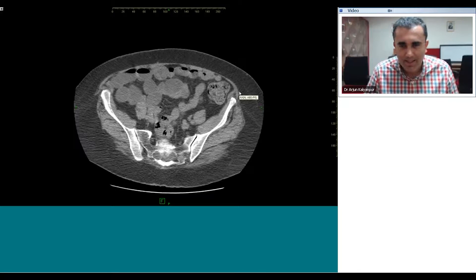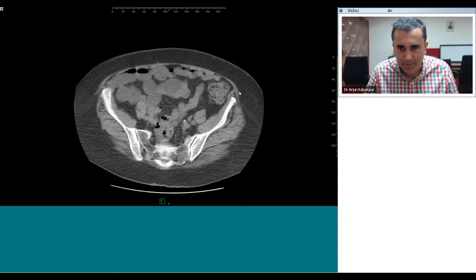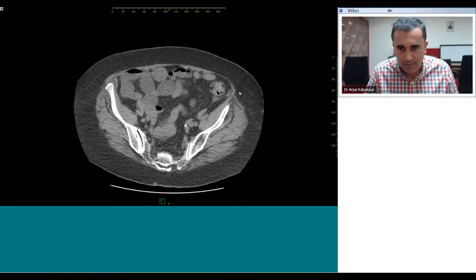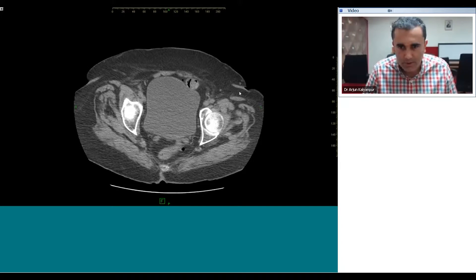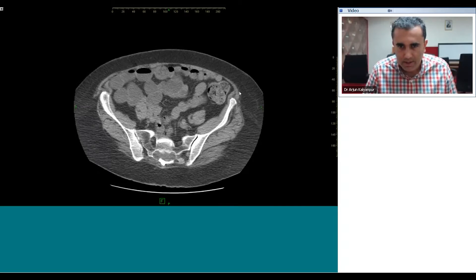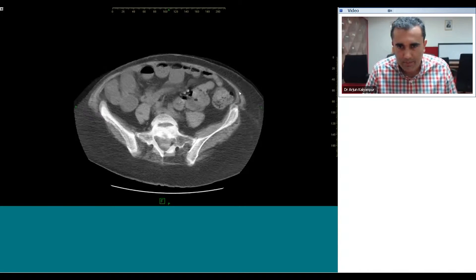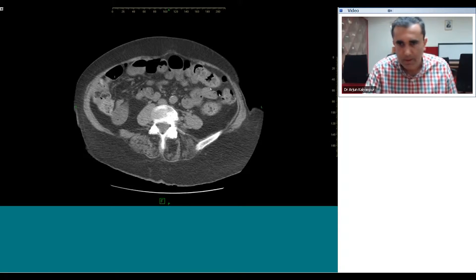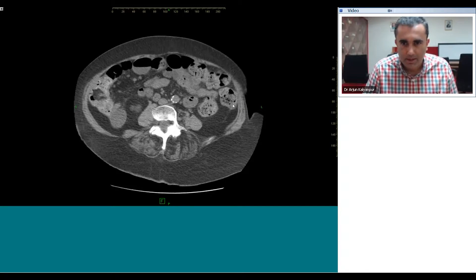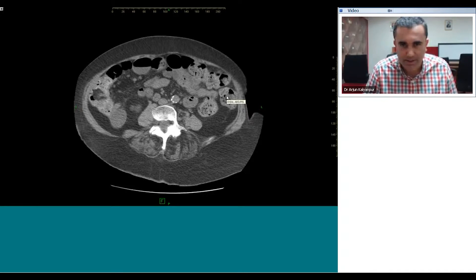Hi there. This is an interesting abdominal CT from the emergency room. It's a CT done without intravenous contrast and we're starting from caudal to cranial. As we scroll through the abdomen we start to see some dilated small bowel loops with fluid levels. The colon is non-dilated and contains some stool, but the disproportionate dilatation of the small bowel relative to the large bowel indicates the patient has a small bowel obstruction.